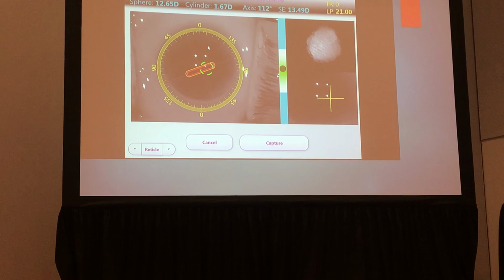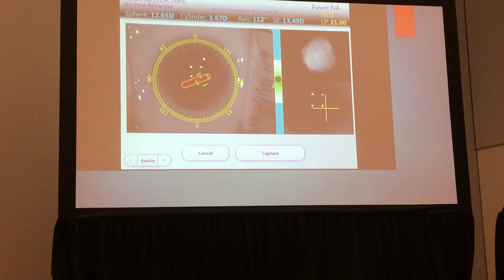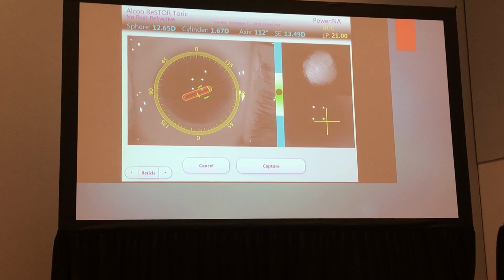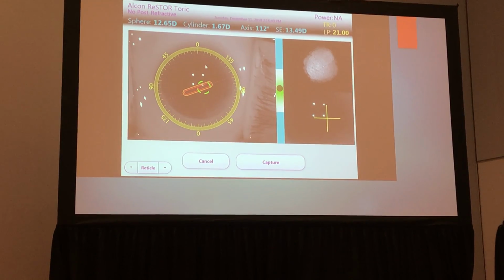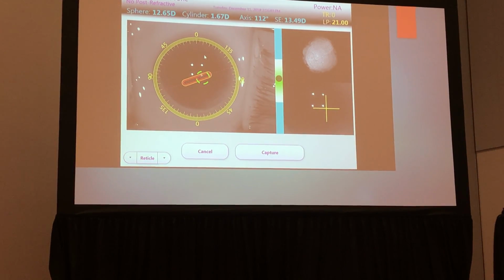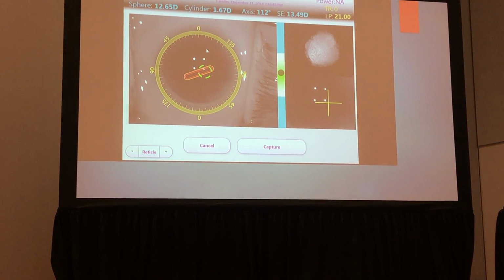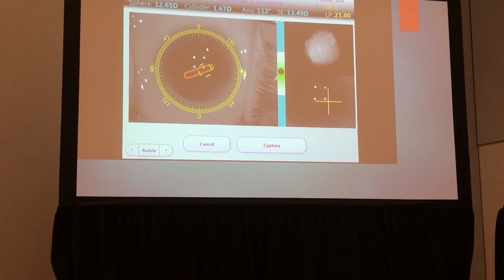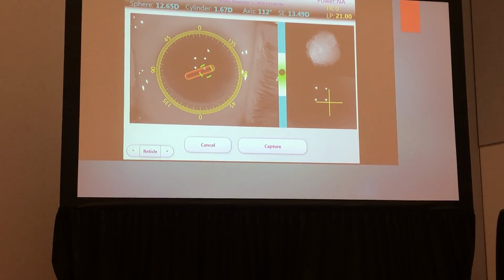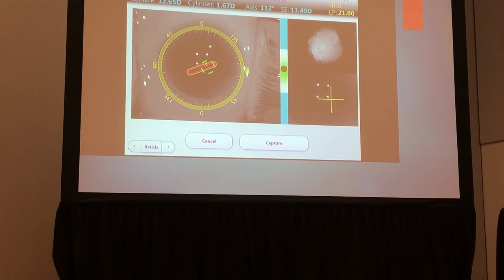All right, so the beautiful thing about femto is that you have registered the patient sitting up in your office. You've taken the picture, and now you have the patient laying down under the laser, and it will look for scleral vessels, and then it will look for iris crypts, and match any cyclorotation. So when you put the arcs on, you have them where you have calculated them to be, and it'll also show you the degree of cyclorotation. So then you can go into the OR, and let's say I often am doing a combination of arcs and toric IOL. And I might do very small arcs, 20-degree length, just to mark the axis properly.